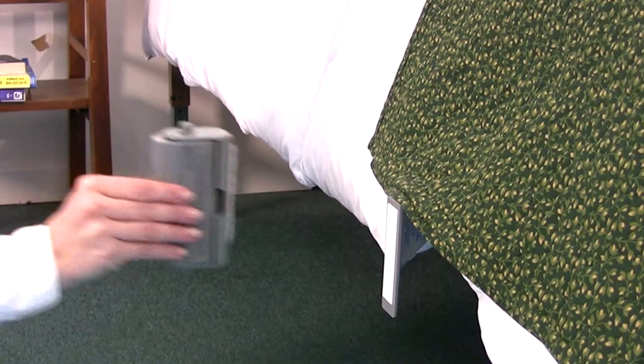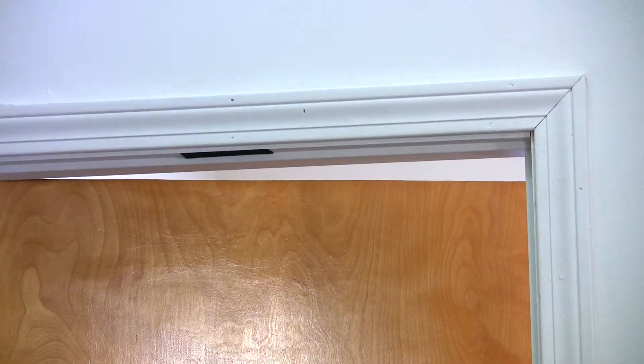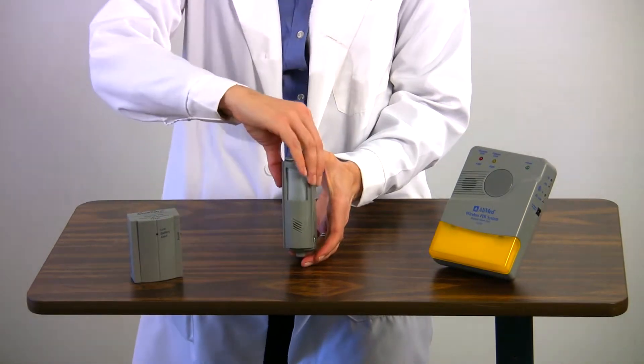It can be placed on the side or at the foot of the bed or at the headboard. You can even place it above a doorway for patients who tend to wander. System 4 bed alarm with remote receiver and nurse call receiver comes installed in a swivel mounting bracket and includes one 9-volt battery.